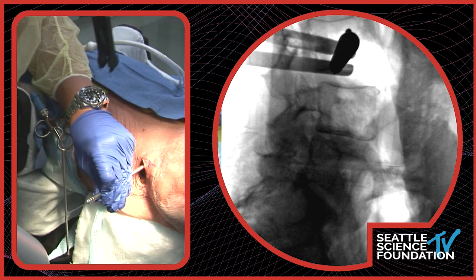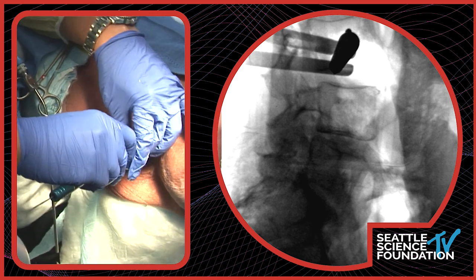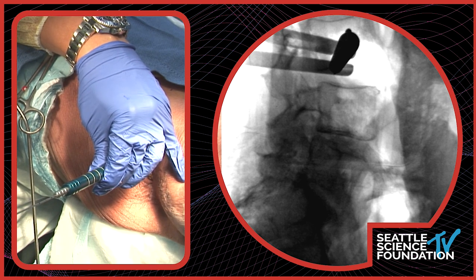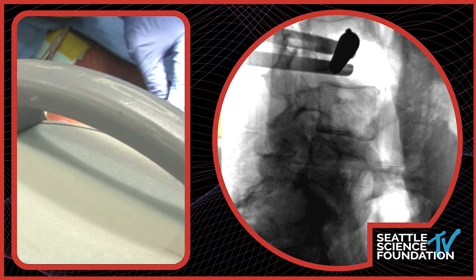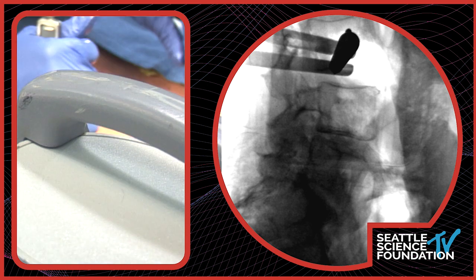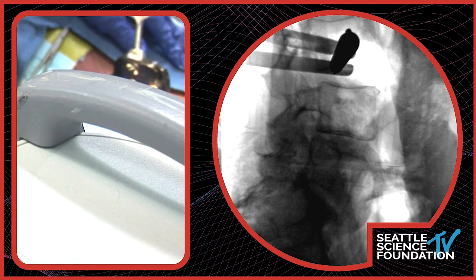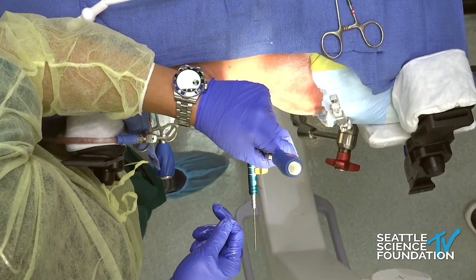Basically we would stimulate in all directions, make sure you have good thresholds with the EMG, and then dilate down. This is a thinner patient so you'd probably use a shorter retractor, but here we'll use 130 because it's closer to what you might encounter in real life. This is a three-bladed retractor — the same retractor that you would use in this system if you're doing a lateral decubitus. They have adapted this for the prone lateral workflow.